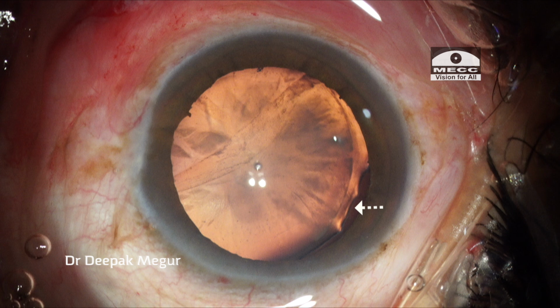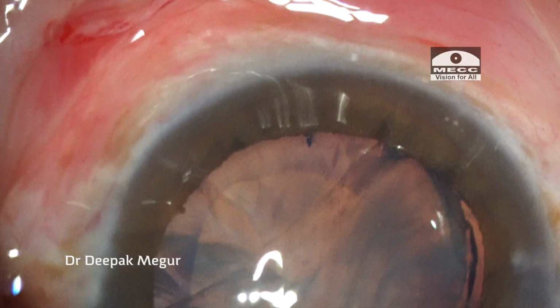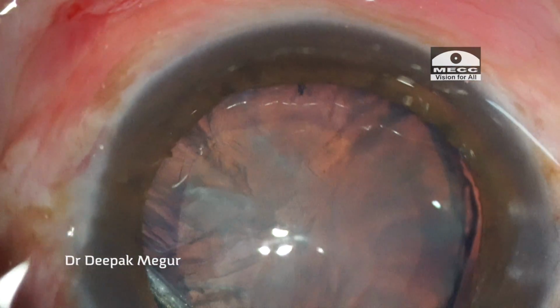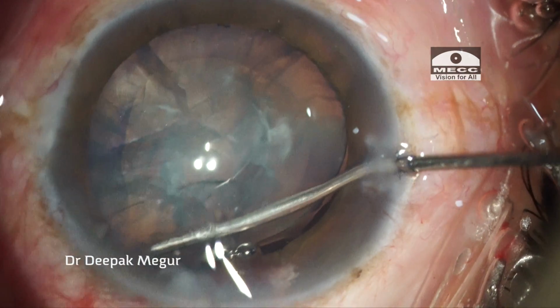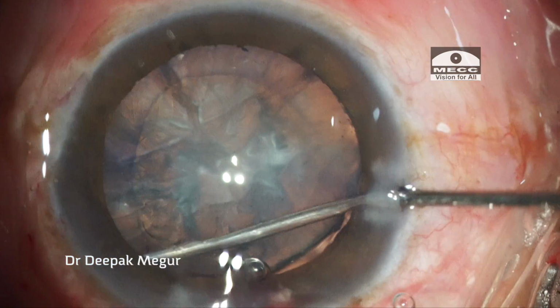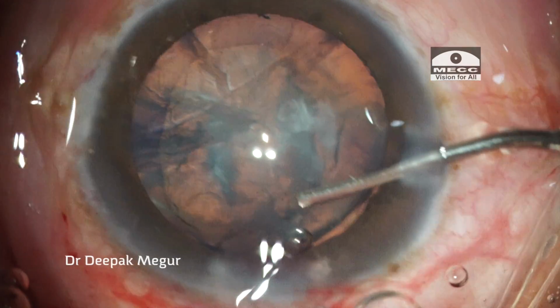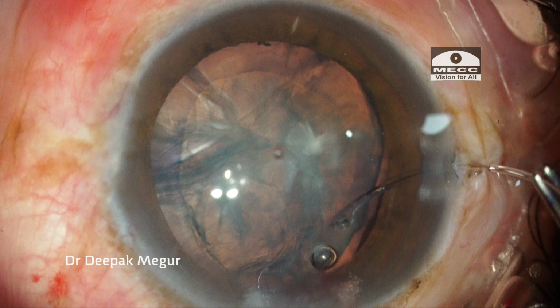This is a case of a localized zonular dehiscence. After rhexis has been performed, cortical cleaving hydrodissection is done, which is so critical in these eyes. After hydrodissection, I am injecting cohesive OVD, sodium hyaluronate, under the capsule. This viscodissection helps to create space between the capsule and the cortex. And then the CTR is manipulated through the side port using forceps bimanually.